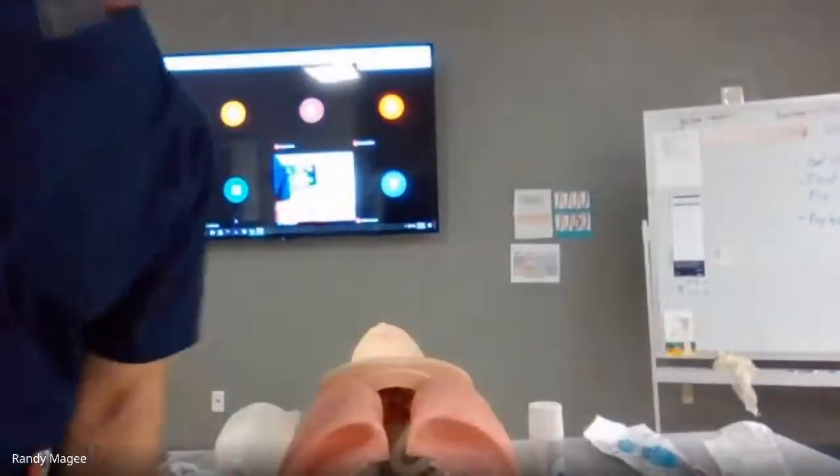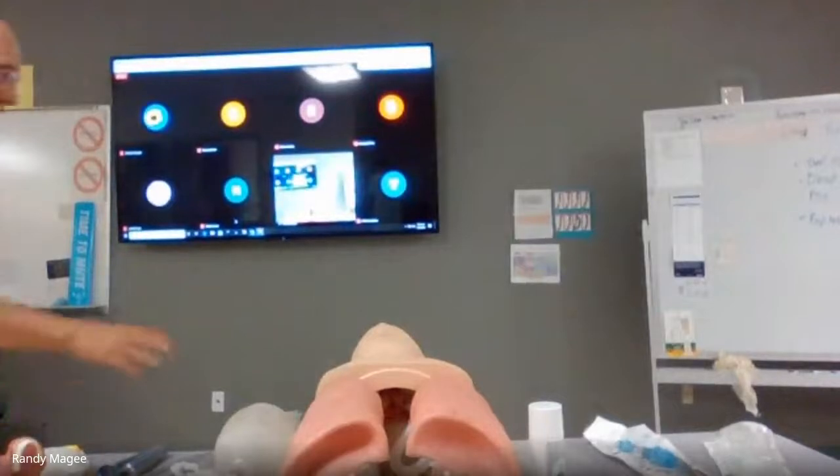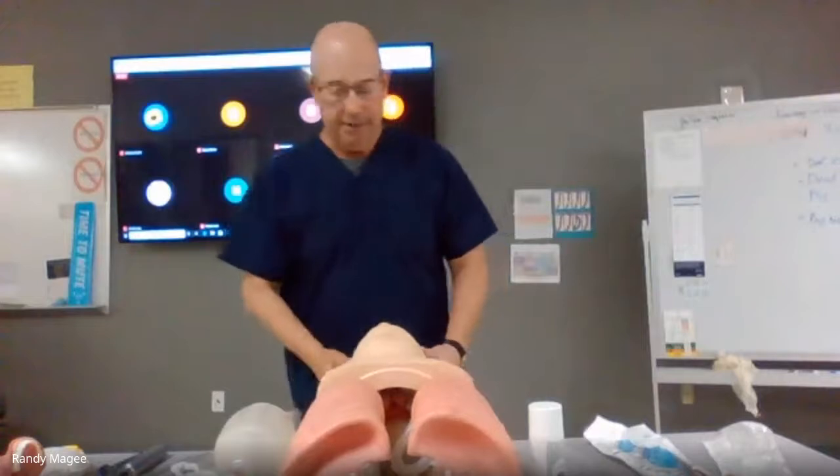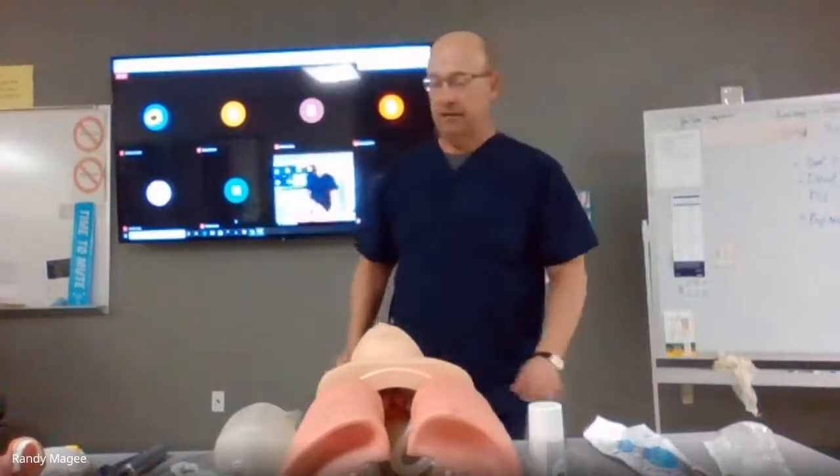Okay, so you guys come on up so you can see a little bit. Just stay sort of back there somewhat. And we're talking about intubation.